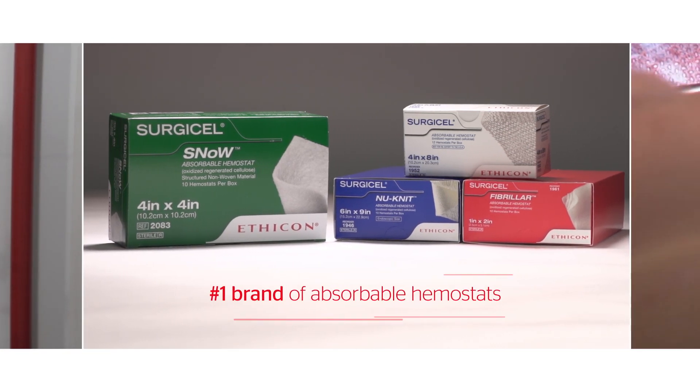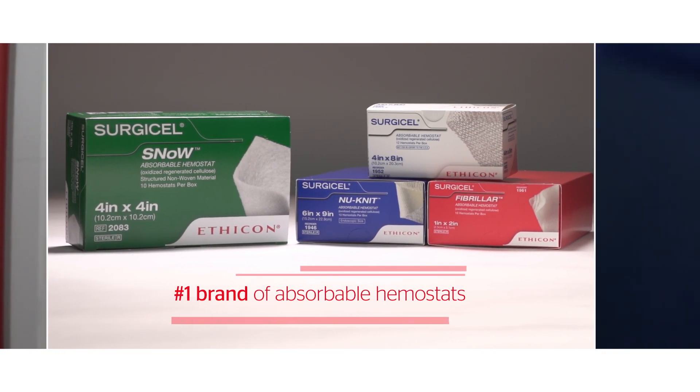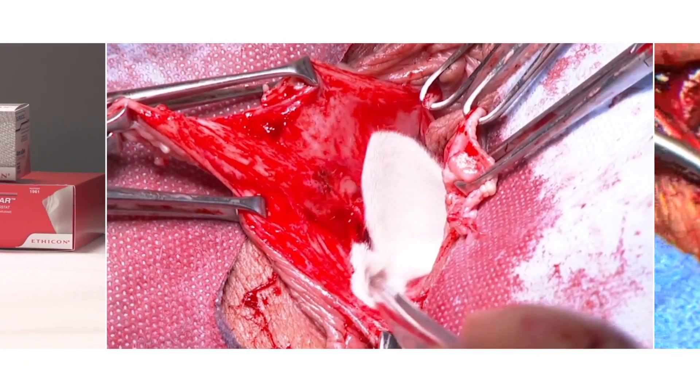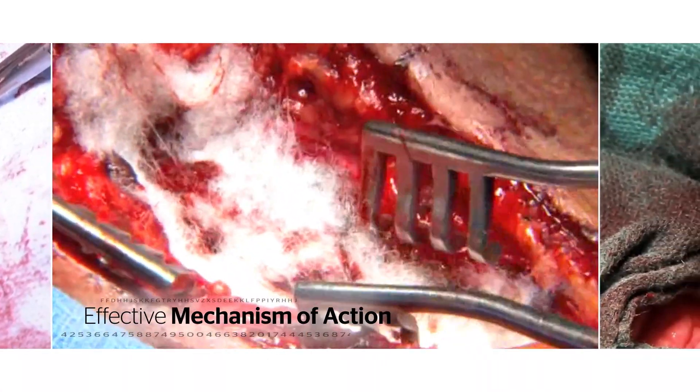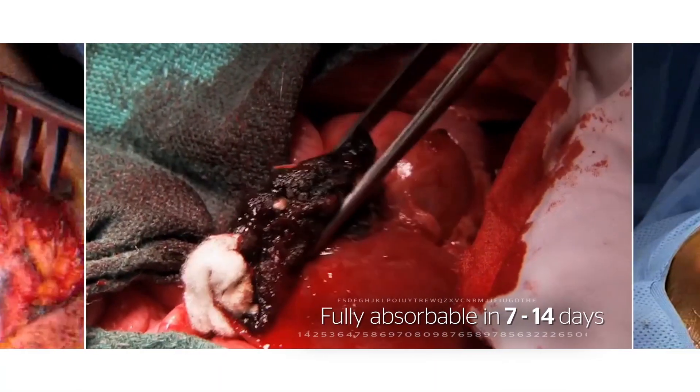For over 50 years, surgeons have trusted Surgicel for consistent control of continuous oozing bleeding due to an effective mechanism of action and a safe, reliable absorption profile.